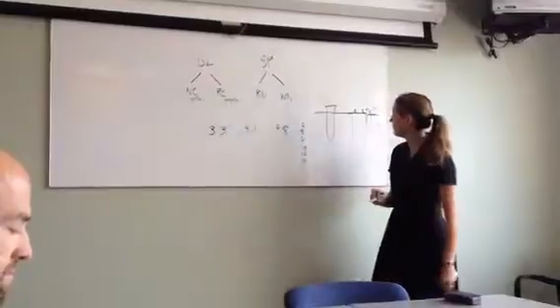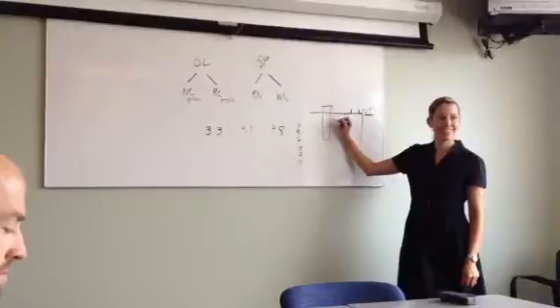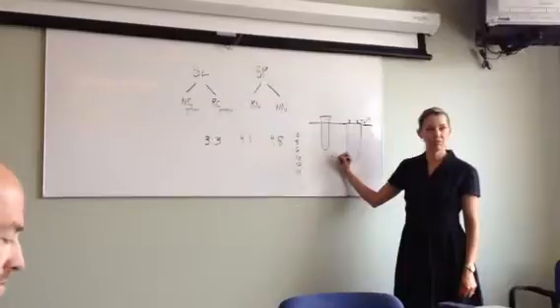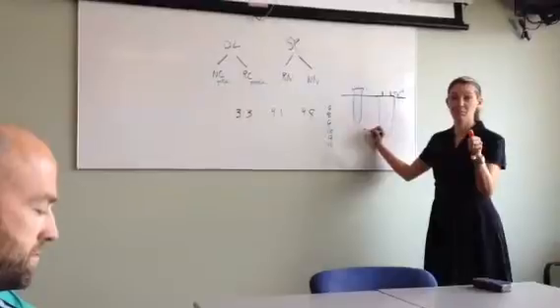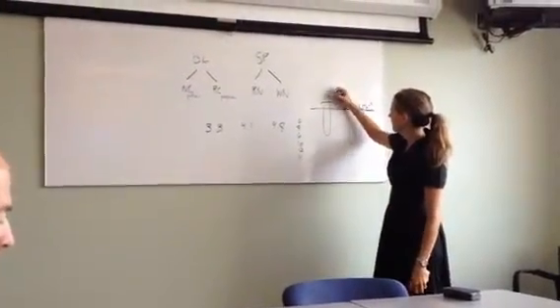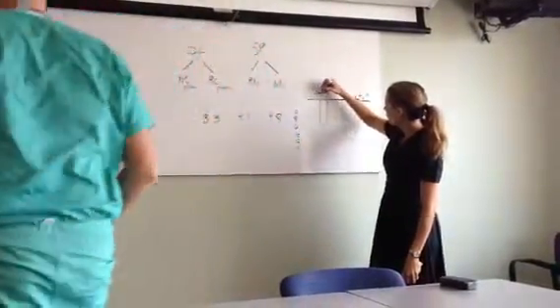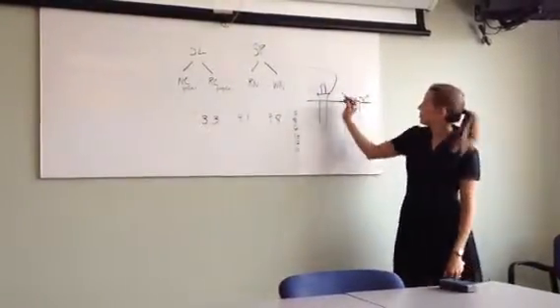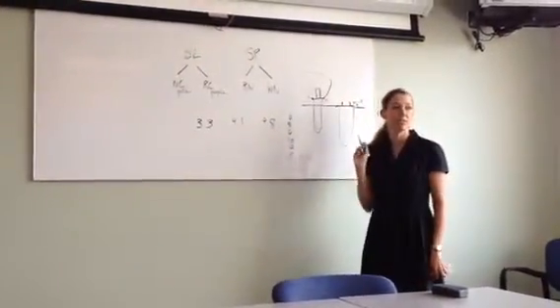If you have a tissue level implant, do you have bone loss in general? No. Why? It's not platform shifted. The microgap is 1.8 millimeters above the bone. The microgap is up here. Here is our abutment, which is actually internal with this implant, and your crown margin is going to be right here on the bevel.